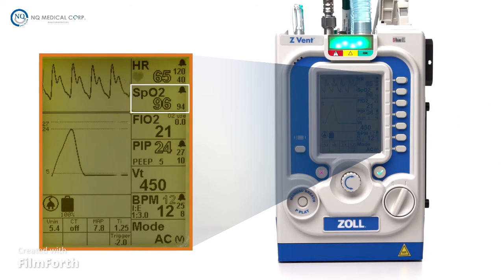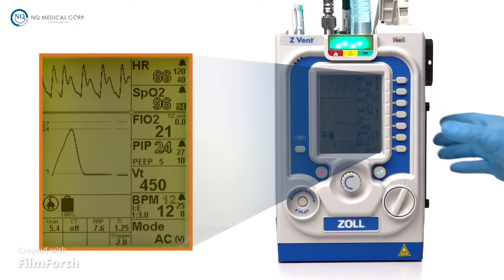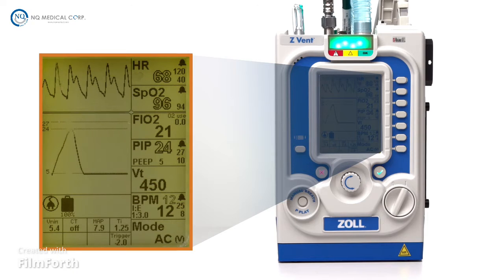The second parameter window is pulse oximetry, or SpO2. The outlined text represents the patient's current measured SpO2 level. The low alarm defaults to 94% SpO2. Press the parameter button once to change the low alarm limit. When a pulse oximeter is used, the pleth waveform is displayed in the waveform window directly to the left.